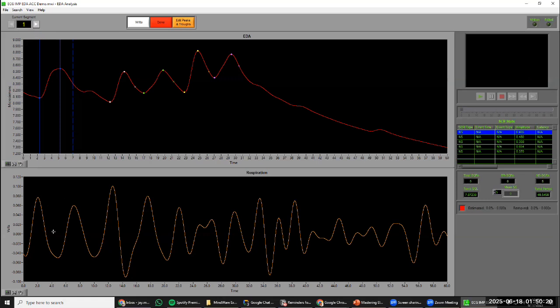So in this case, what we're looking for are respirations that are usually on the order of 2 or 3 times the magnitude of anything else on the screen. So if we pick this one, the largest respiration, is it 2 to 3 times as large as the surrounding ones? No, it's just barely a little bit larger, so we don't have to concern ourselves with it.